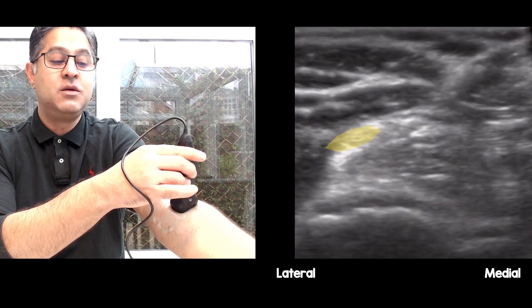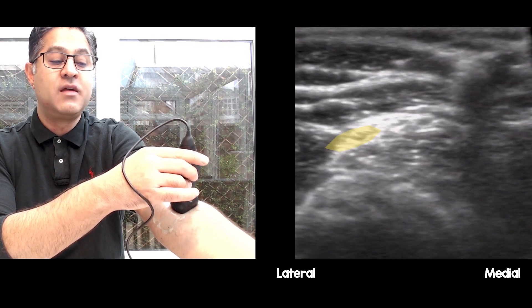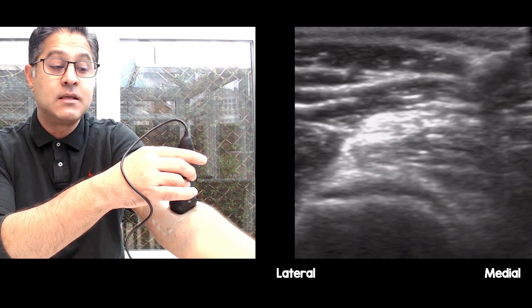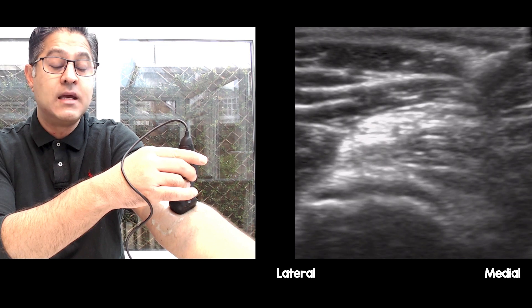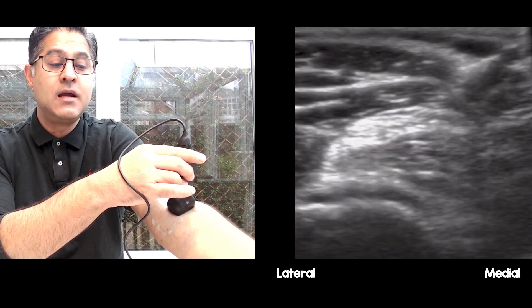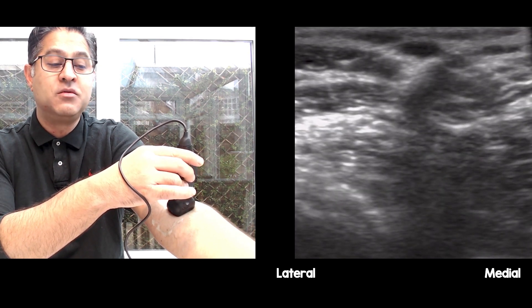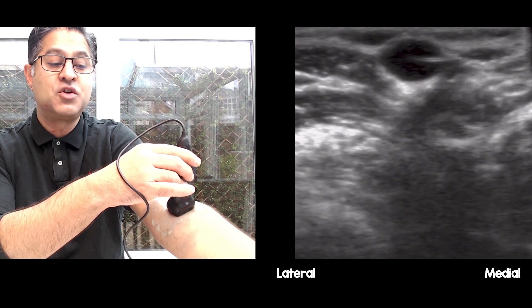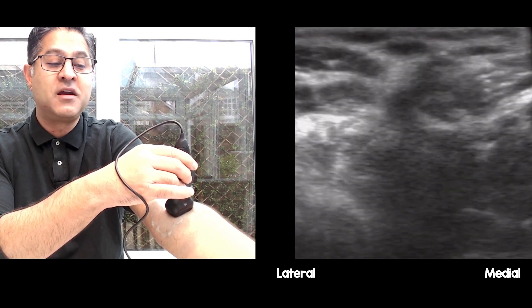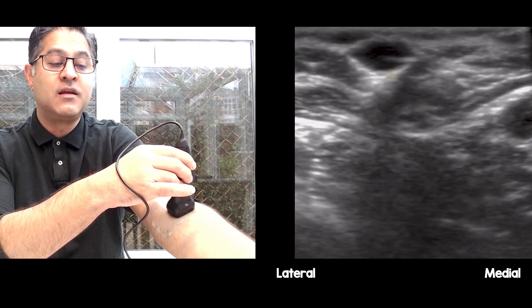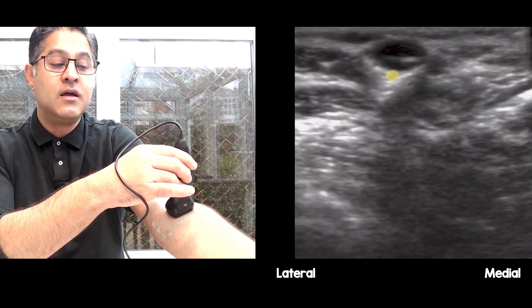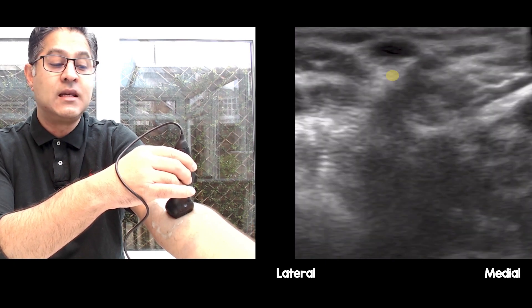I then slide the probe laterally, and as I go laterally I start to see the superficial radial nerve, sandwiched between brachialis and brachioradialis. Now I come back slightly medially on the antecubital fossa and release the pressure — you can then see the cephalic vein.